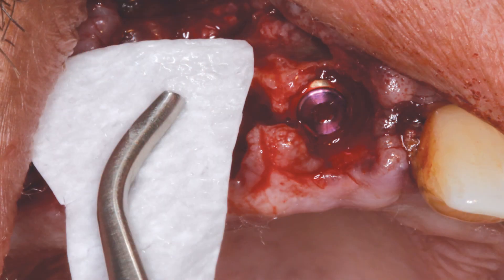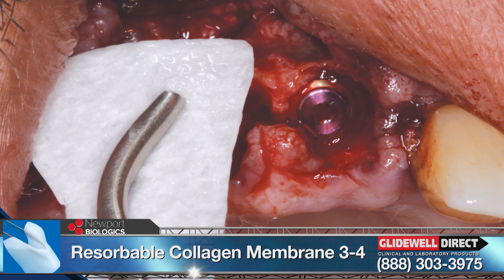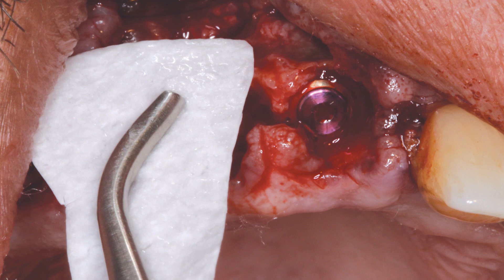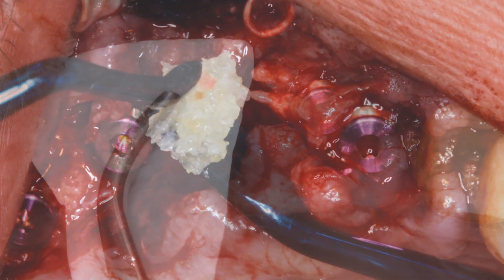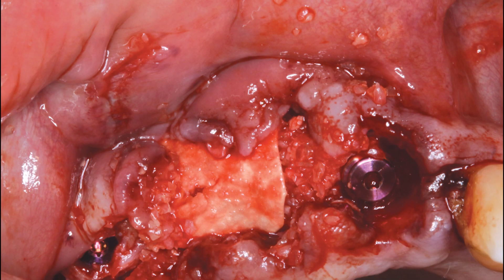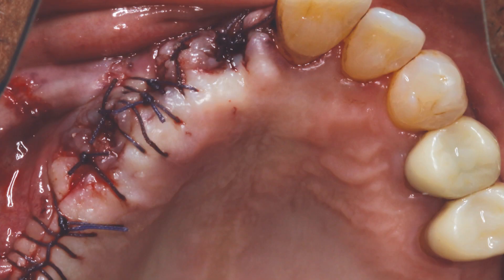Because we did have some defect, the Newport Biologic Resorbable Collagen Membrane — three to four months — was cut to size to extend beyond the defect, which would be corrected with allograft material. This membrane prevents invagination of epithelial tissue into the healing wound. The Newport Biologic Cortical Cancellous Allograft Blend was placed firmly but carefully and the membrane was passively tucked facially and palatally. This is critical. We then closed the site using vicryl sutures, which closed the reflected gingival tissue.